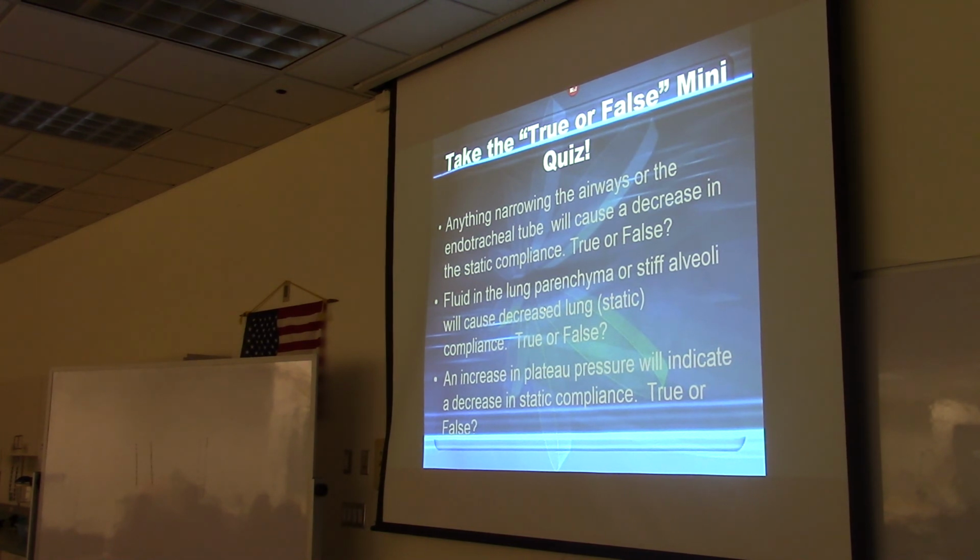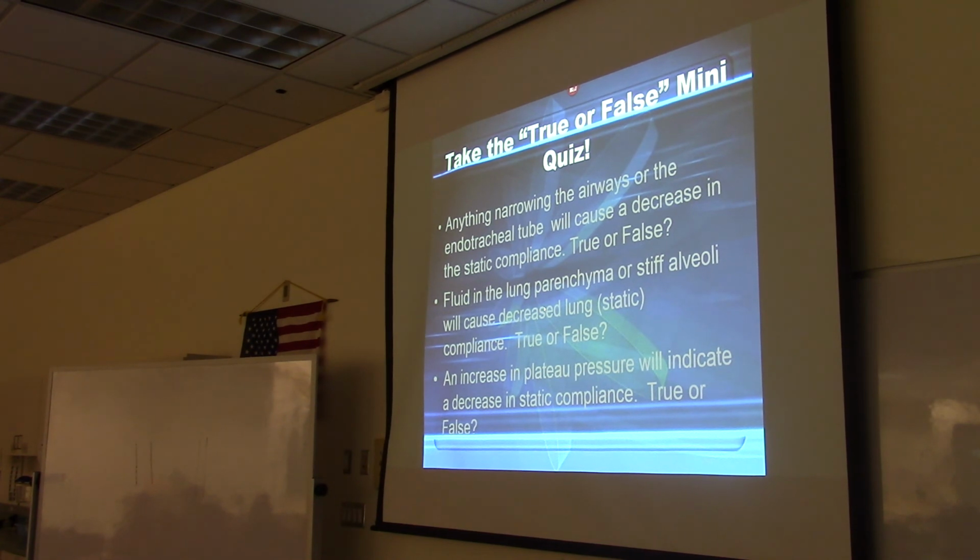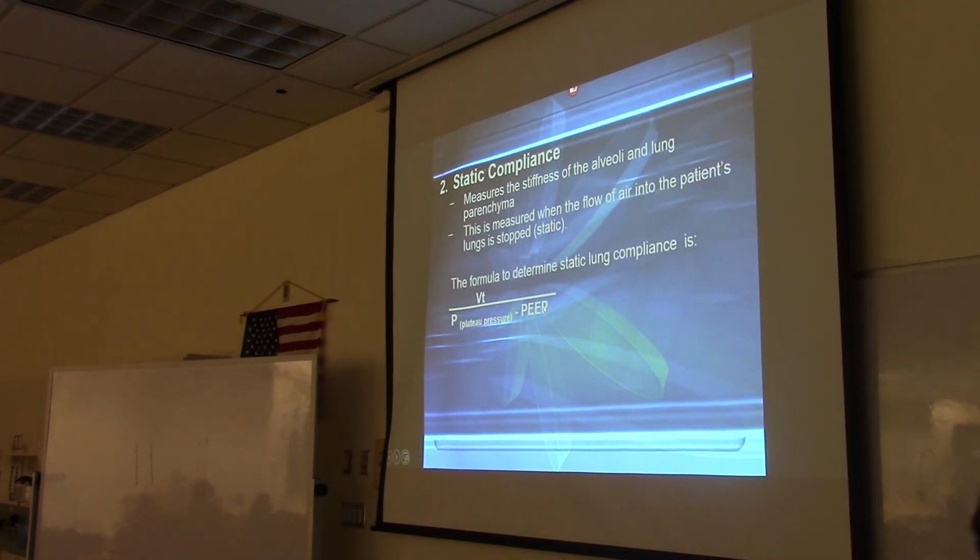Fluid in the lung parenchyma or stiff alveoli will cause decreased lung compliance. Is this true or false? True. It's true. So when you have stiff lungs, you're going to have a low number for your compliance reading. An increase in the plateau pressure will indicate a decrease in static compliance. So higher pressure, will that make the... So if you have a bigger number down here, is that going to result in a smaller number when you divide?